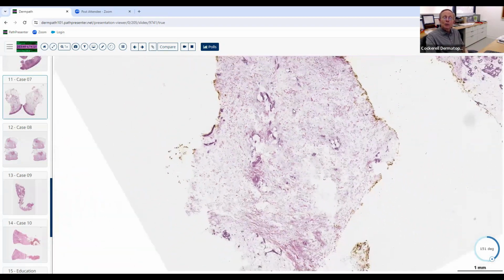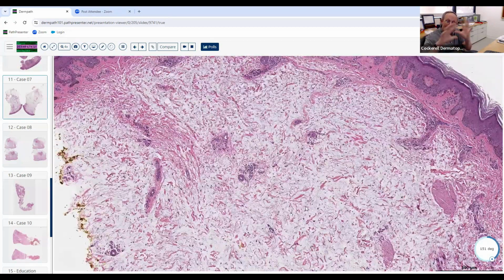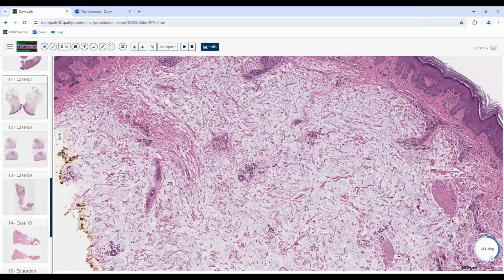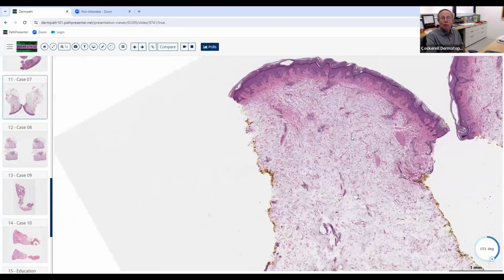Now, there's one cutaneous neoplasm where we see a lake of mucin associated with little islands of epithelial cells within that lake of mucin. Do you know what that tumor is? I don't specifically. Mucinous carcinoma of eccrine glands. Okay. So remember that. And mucinous carcinoma, breast metastatic mucinous carcinoma, they get lots of mucin, a lake of mucin, and then they'll get these little aggregations of epithelial cells within them. So remember that one also.